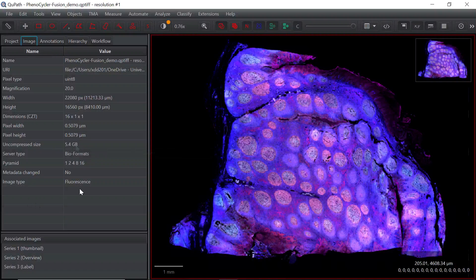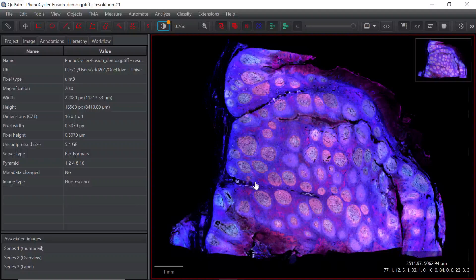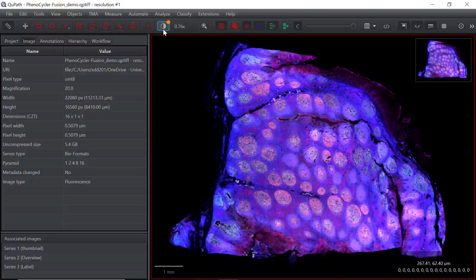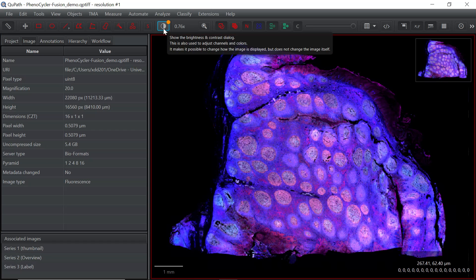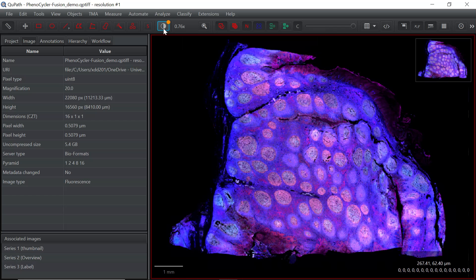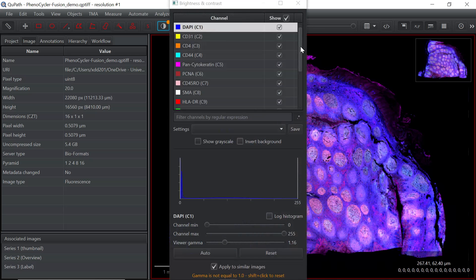The image type is fluorescence. This dataset used 15 antibodies plus DAPI, so in total we have 16 channels. You can click the brightness and contrast button to see the channels. It shows the channel information and the color for each channel.